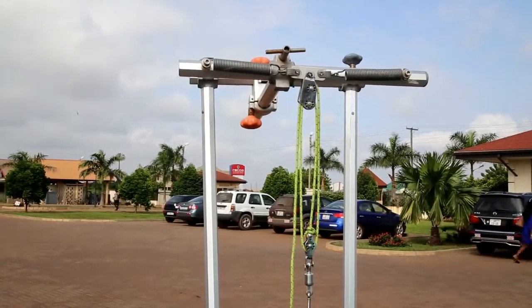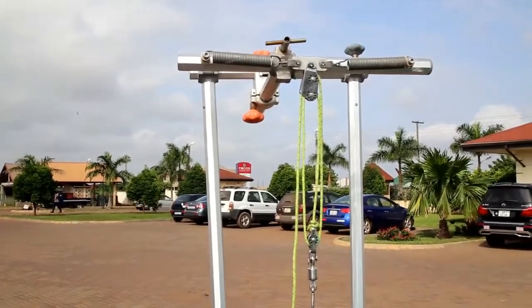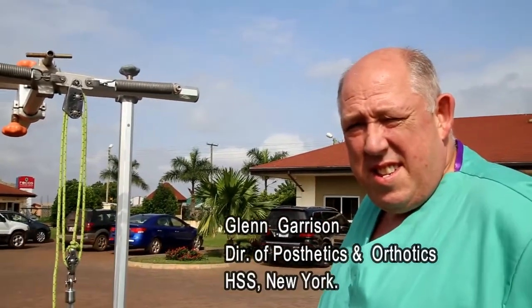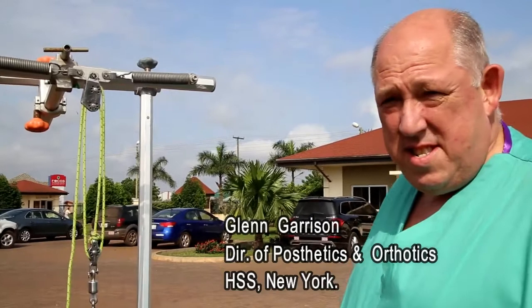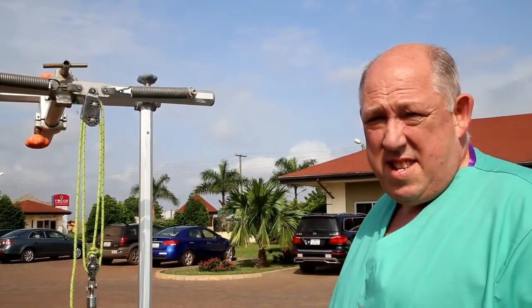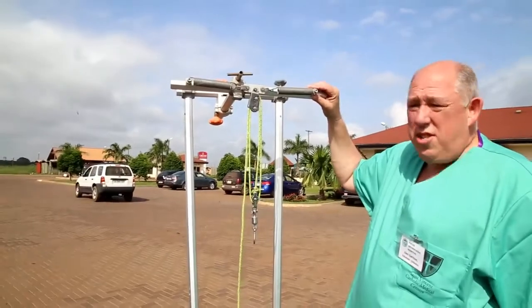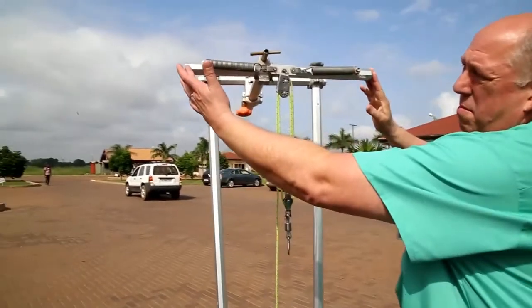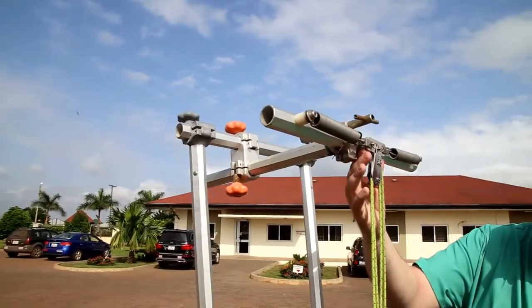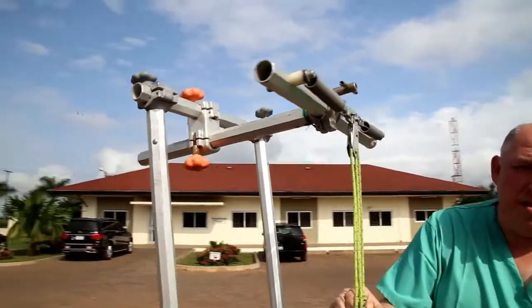This is a demonstration of the spring-loaded traction system used at the Focos Orthopedic Hospital. Glenn, the Director of Orthotics and Prosthetics at Special Surgery, is going to take us through the components of the system, how it is assembled and how it is applied. The spring-loaded traction system consists of a bar with two horizontally mounted springs, a common attachment piece, and a series of pulleys.